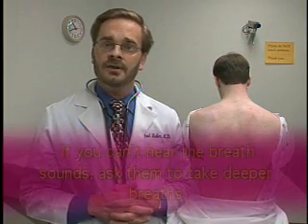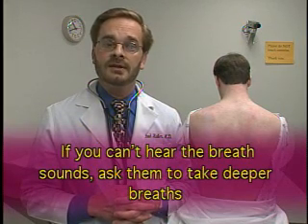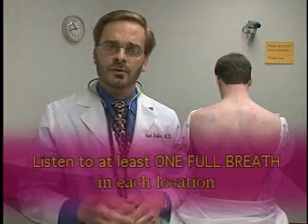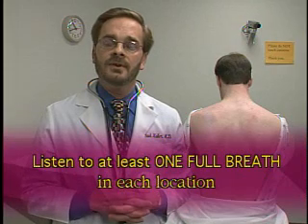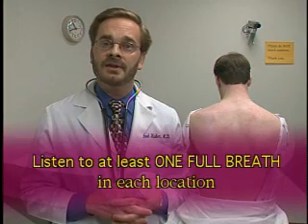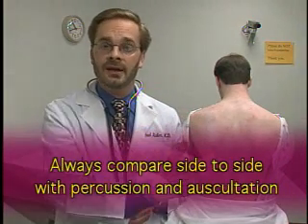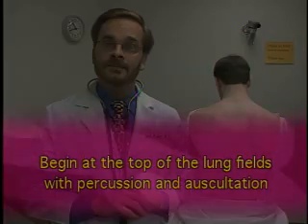But if you're unable to hear the breath sounds, then ask them to take deeper breaths as you listen and auscultate the lung fields. And again, remember, don't move your stethoscope too quickly from one side to the other. Let the patient go through a complete respiratory cycle before you move your stethoscope. The common mistake would be that students move before the patient's completely finished exhalation. And again, always compare right to left at any given level, and start at the top of the lung fields.